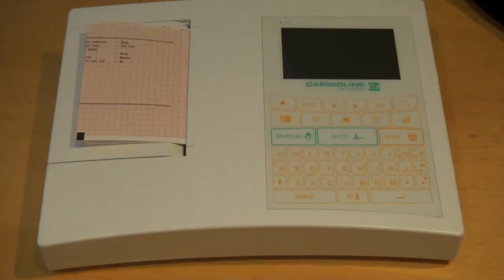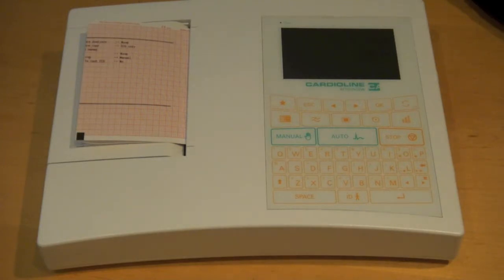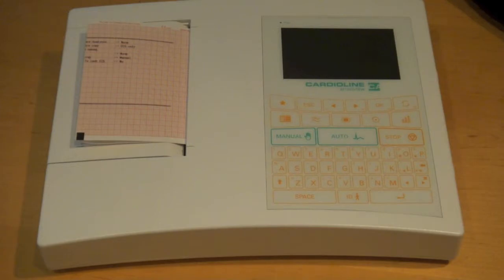Thank you for visiting Cardiac Direct. Today we'll be taking a look at the Cardioline AR-1200, which is a six channel EKG machine.